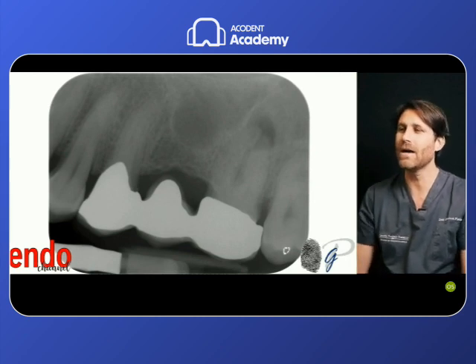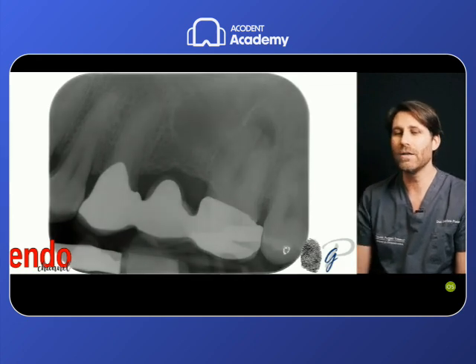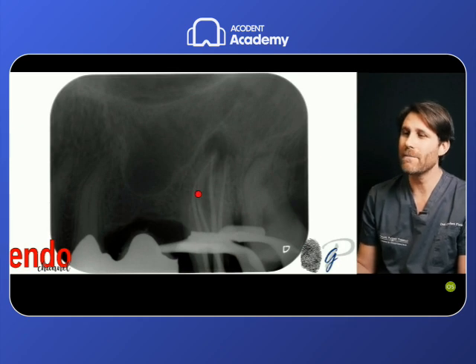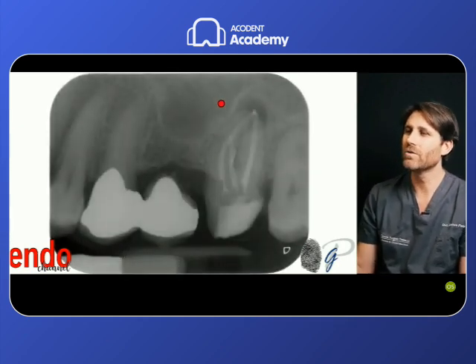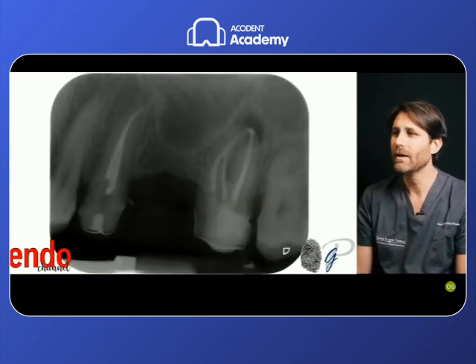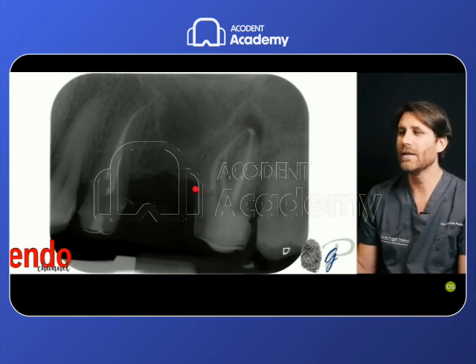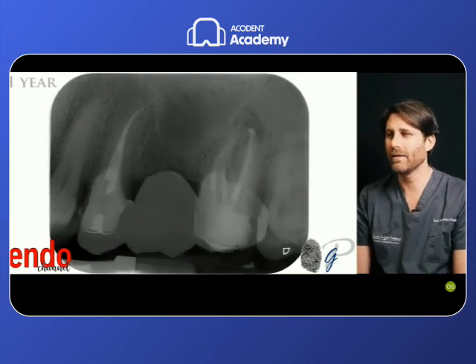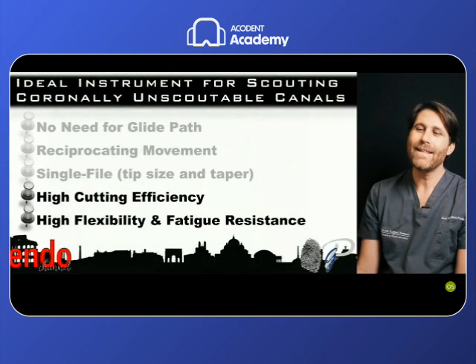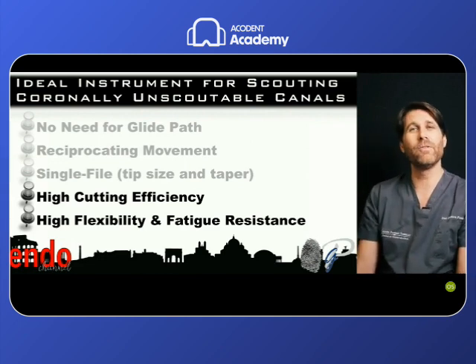As it happened in this other root canal, the second upper molar with this big periapical lesion, after removal of the bridge, it has been endodontically treated, and also the MB2 root canal, even if confluent, was treated with this technique, with respect for the root canal anatomy and trajectory, respecting the thickness of dentin there in the mesial aspect that permits us to build up a restoration that can be long-lasting.